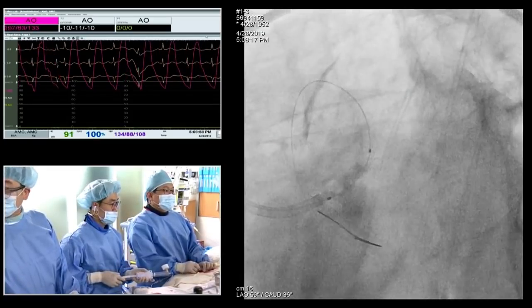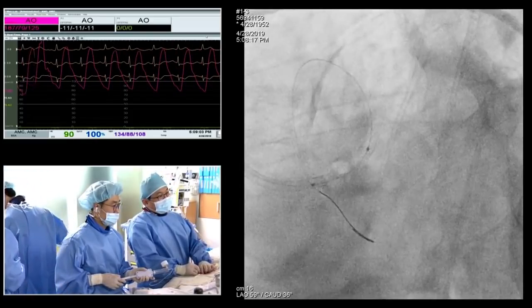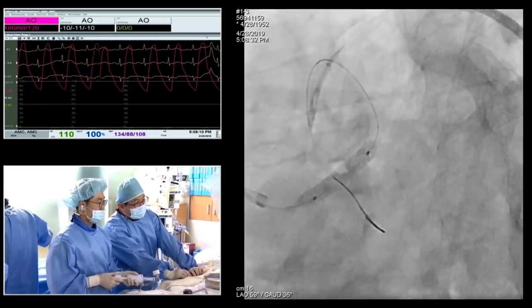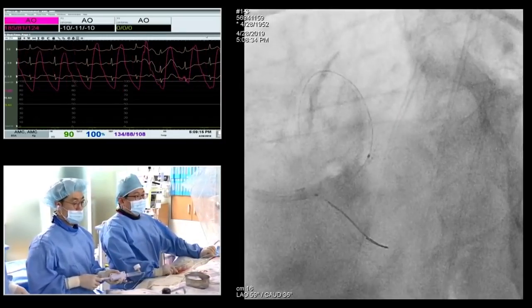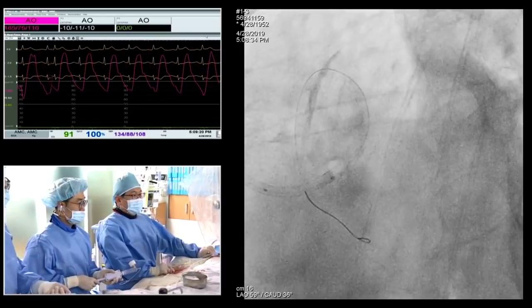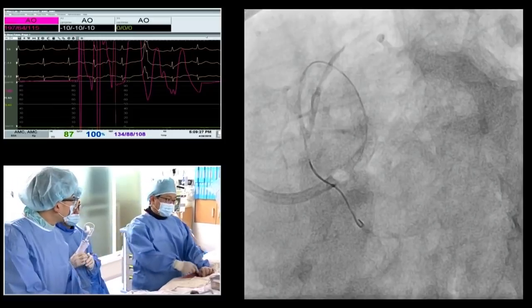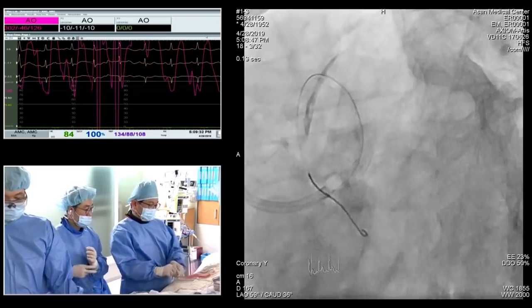Charlene, we are discussing about distal part, proximal part, right? However, look at this. I want to just say, we don't have data yet, right? After the balloon crush, the proximal stent is very minimal part of a crush like this, right? Angiographically, we're going to confirm a little bit distal. However, sometimes it's a proximal distal. It's not a big difference. It's not a big matter, right?